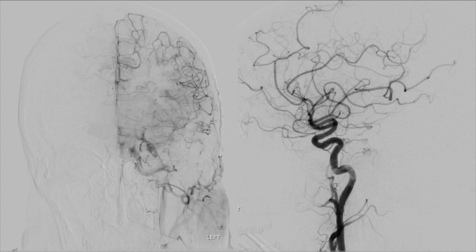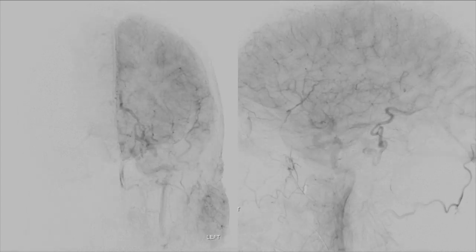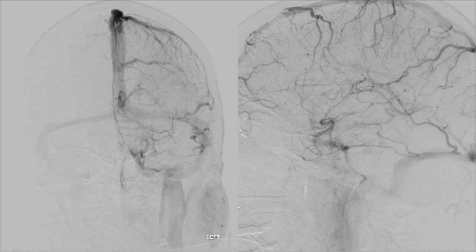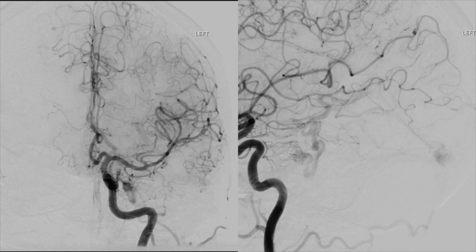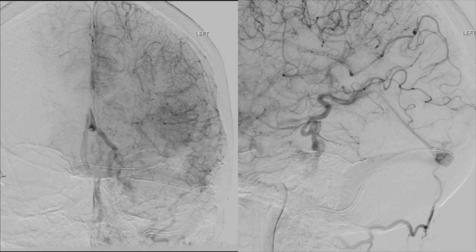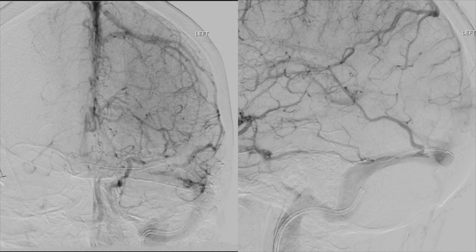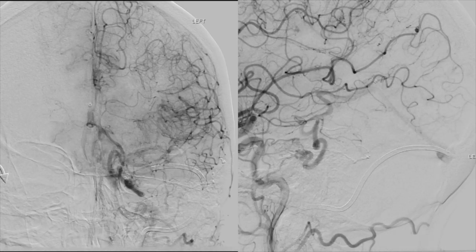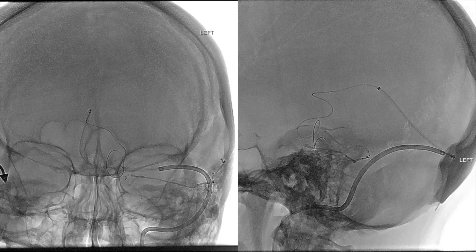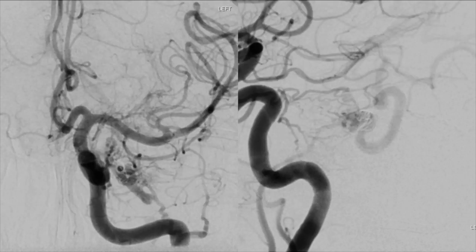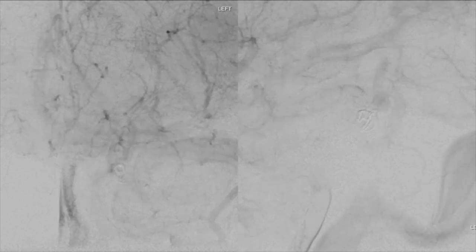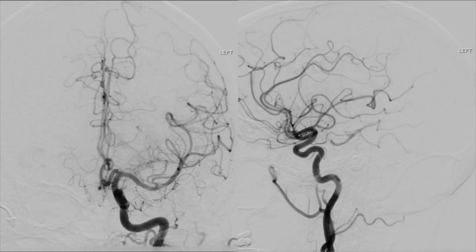At this point, after failure of transarterial endovascular treatment, we had the option of proceeding with surgery or attempting a transvenous approach. After discussing with the patient, we decided to take a transvenous approach with coils alone, with the primary concern that any liquid embolic embolization would inherently trap the microcatheter and removal may cause injury to the very tortuous dilated ectatic deep vein. Fortunately, the nidus was fairly discrete, and using a tri-axial system with a marathon microcatheter, an intermediate catheter at the apex of the straight sinus, and a guide catheter just below it, we were able to access the nidus and place several dense-packed coils to achieve complete obliteration.